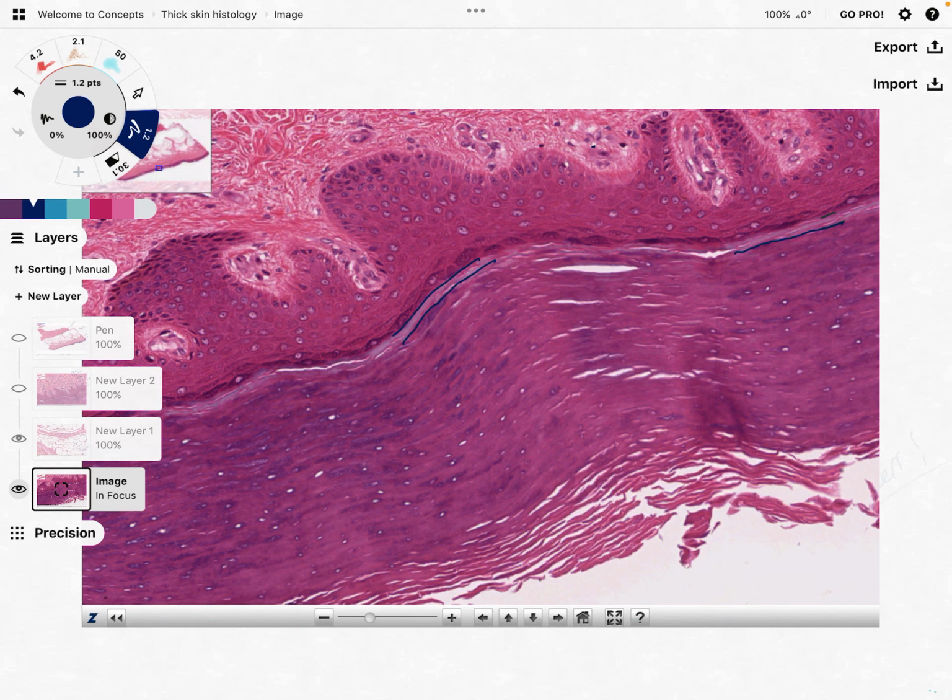You see this kind of clearish layer, typically with a light purple to light blue coloration. It's translucent. You could say maybe there's a pun in there. It's translucent because it contains the stratum, or it is, I should say, the stratum lucidum. So nice when they choose terms that make sense. So it's lucid, it's translucent, it's clearish looking. The stratum lucidum contains mostly proteins, particularly proteins that are derived from the keratohyalin that's produced in the granular cells.